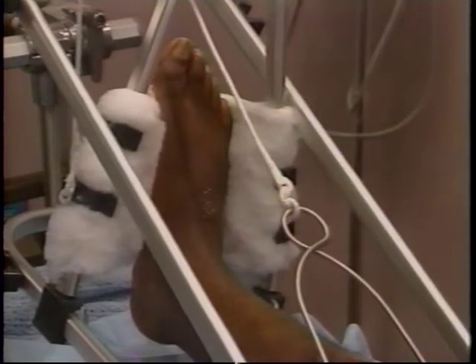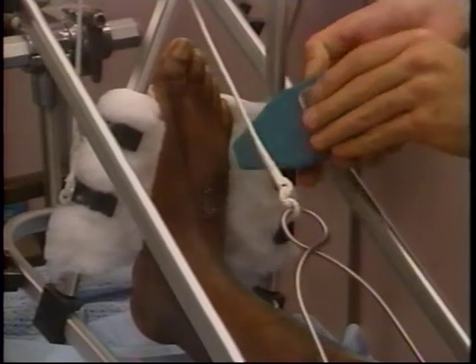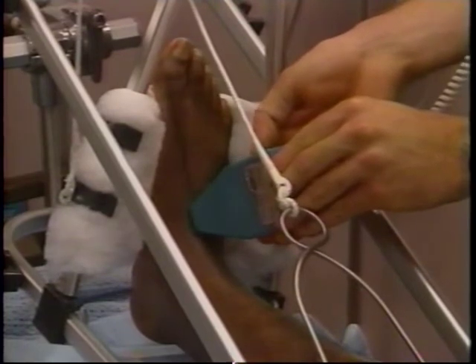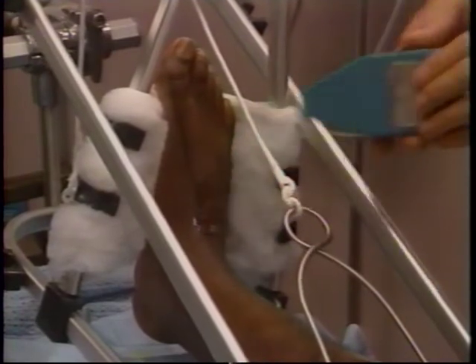Apply a small amount of electrode gel to the pulse site. Turn the audio switch on, apply the Doppler to the area, and listen for the pulse. If the pulse is very hard to find or very faint, mark the area so others will be able to more easily locate the pulse.